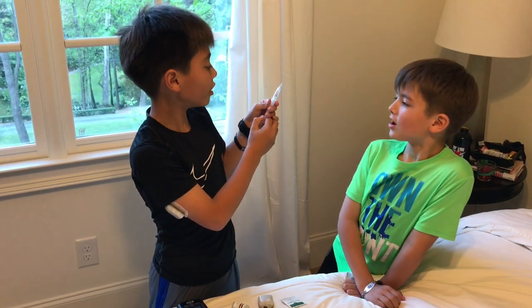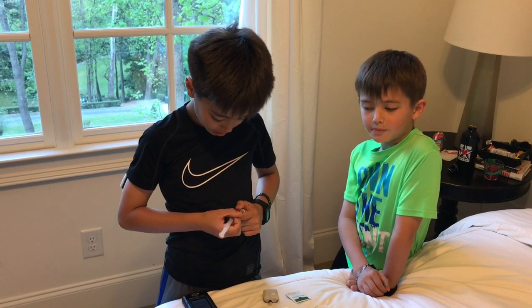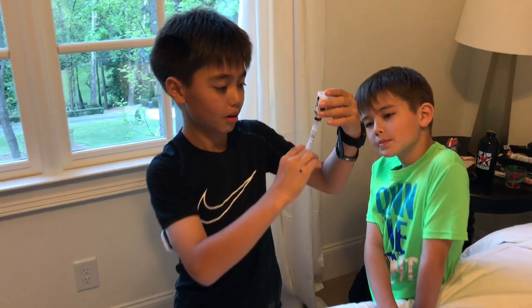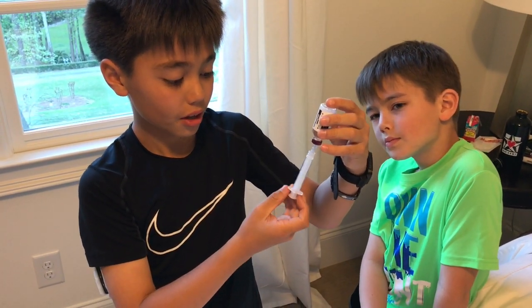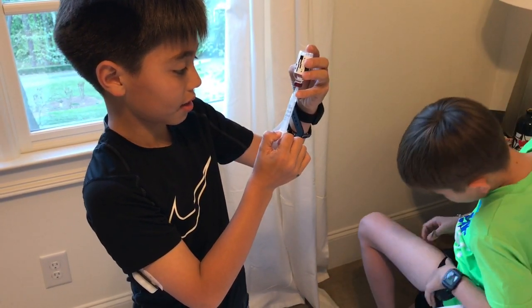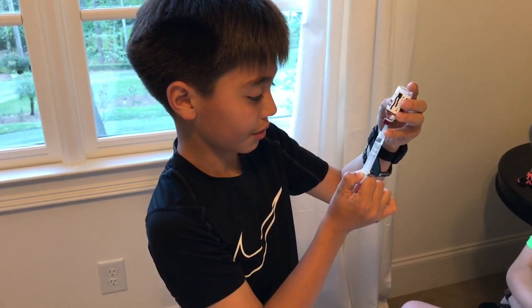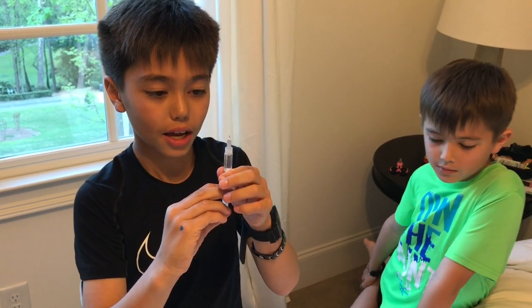Pull the syringe back to about 150 units of air. Push it into the insulin vial, turn it over, then push all the air in. Now, pull out the insulin and fill it to about 150 units or more. Then push all of the air out.